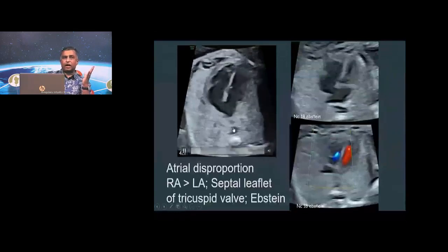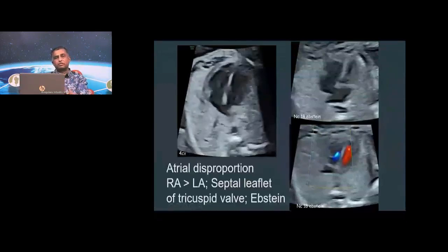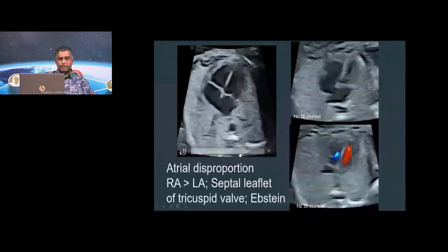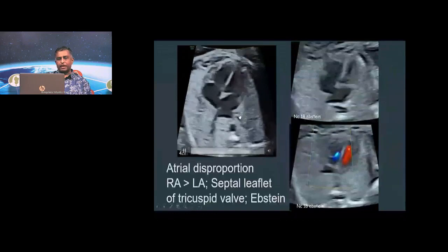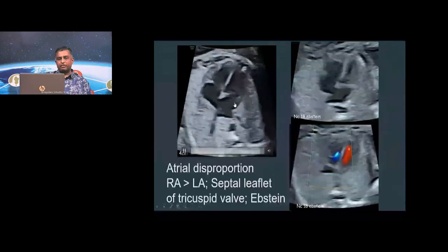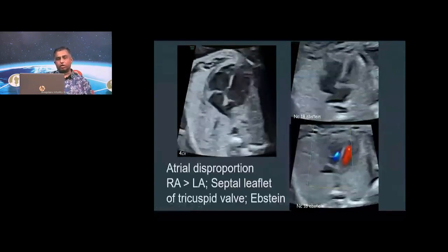Always start with the fetal heart, with the spine. When you see a clip in a conference you're attending, or you're looking at this presentation going on now, how are you going to orient yourself? Look at the spine, and that's the descending aorta. Very close to the aorta is the LA, and you have the pulmonary veins opening in over there. This is LA, and this is LV, so therefore this is the mitral valve. This is left side, this is right side. You've already confirmed that in a preliminary step, which we've already gone through.